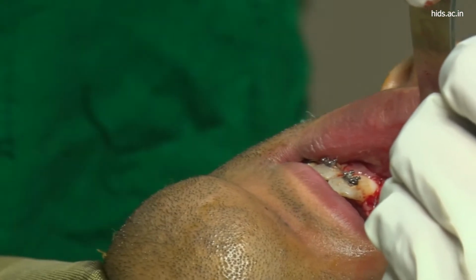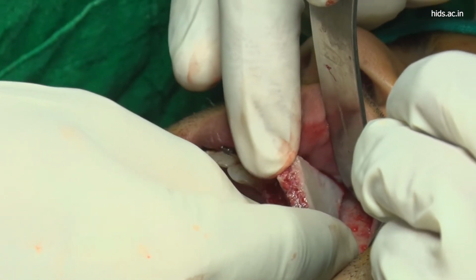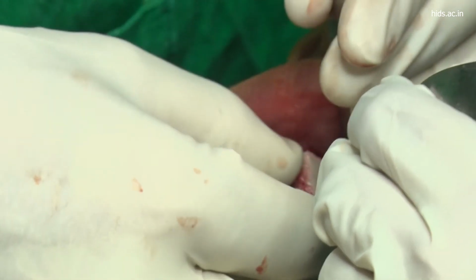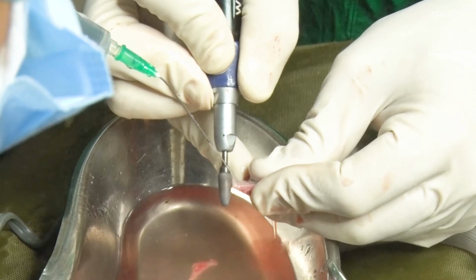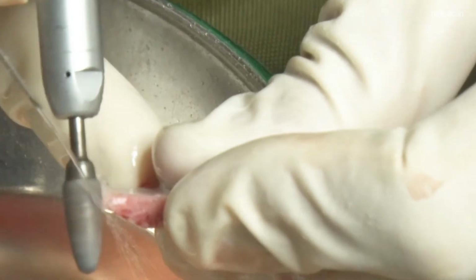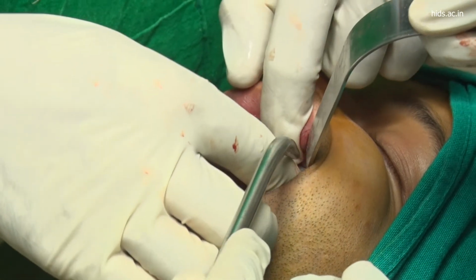Before fixation, we have to make sure that the graft matches the size of the recipient bed. So we will trim the graft wherever it is necessary. Contouring has to be done according to the morphology of the recipient defect site.